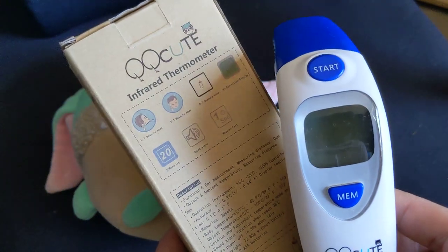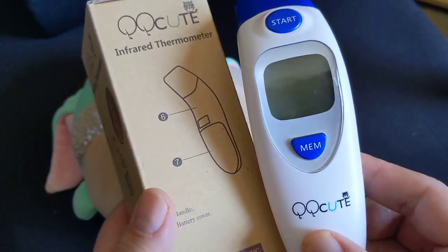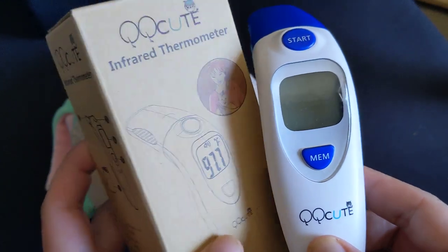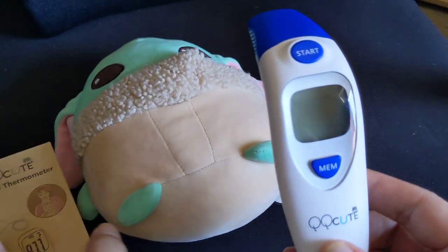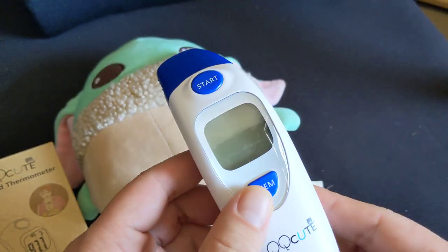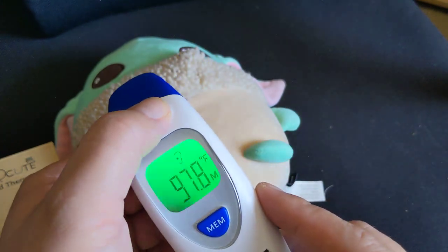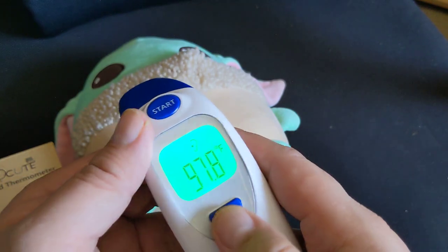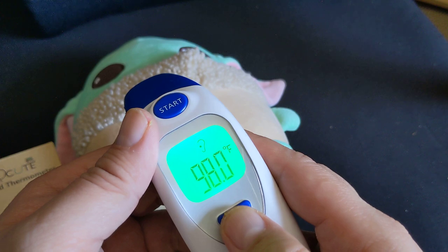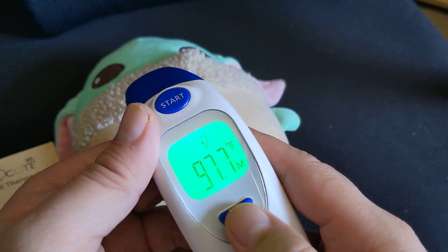This is my short review about the accuracy of this QQQ infrared thermometer, bought in 2017 — five or six years later, finally doing a short commentary. Going from memory, I did five readings of my left and right ears: one time, two times, third time, fourth, and fifth.